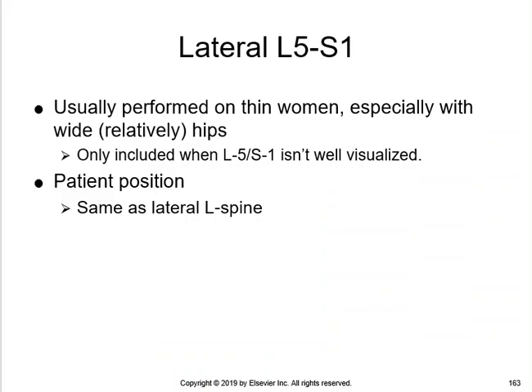The L5S1 spot is used primarily for women who have broad hips and narrow waists, so usually thin women. And it doesn't necessarily have to be really wide hips. It's relatively wide hips in relationship to the waist. So if you have somebody who's thin, a woman who's thin, then in a lot of cases you won't get an adequate density through L5S1.